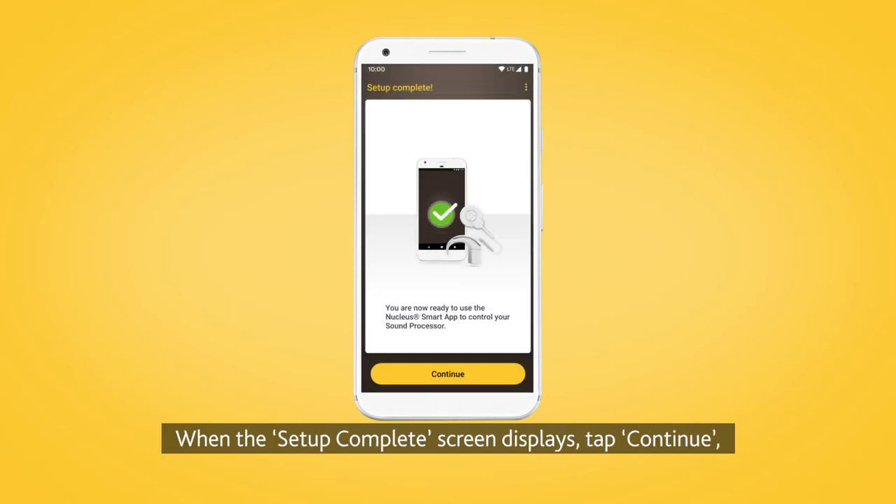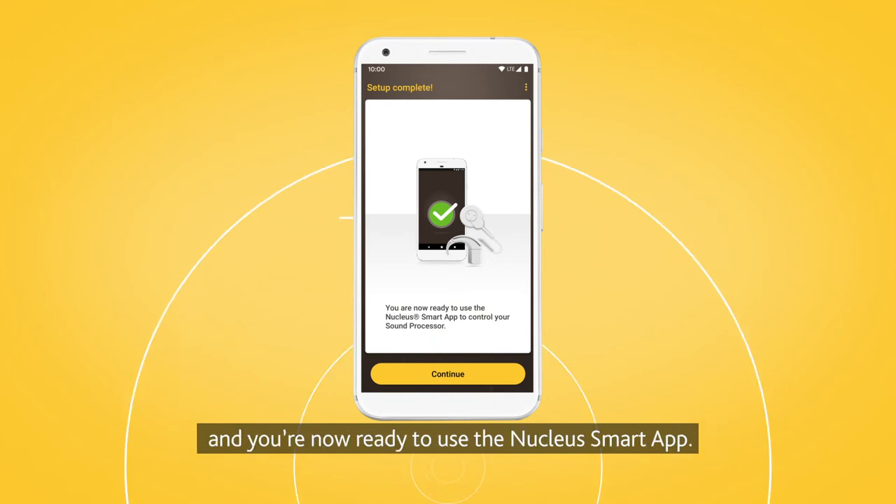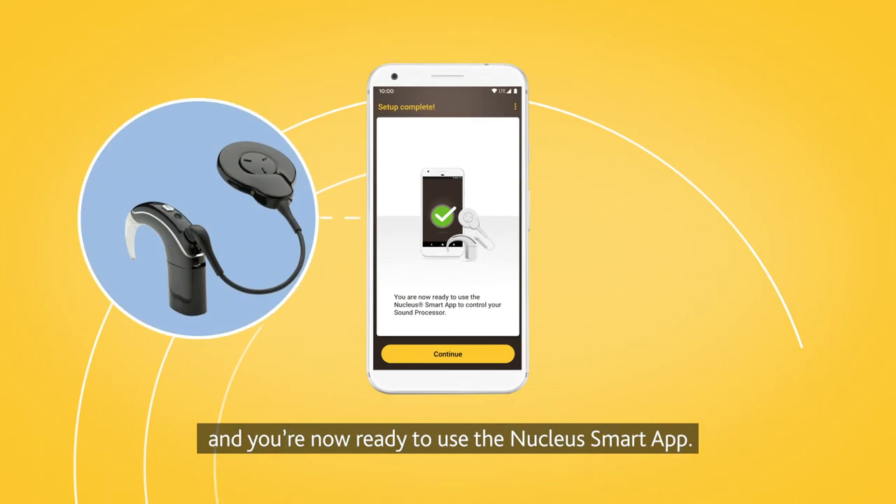When the setup complete screen displays, tap Continue and you're now ready to use the Nucleus Smart App.